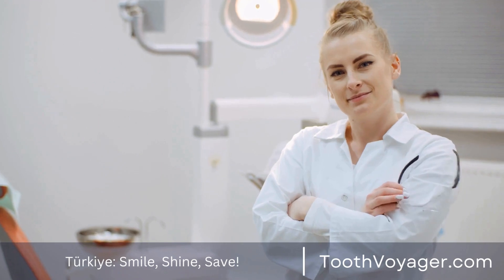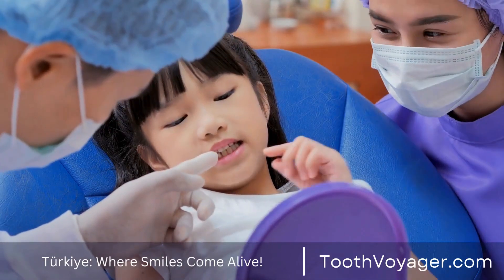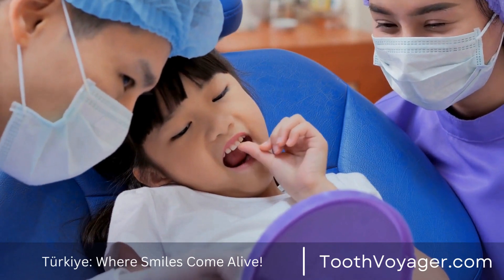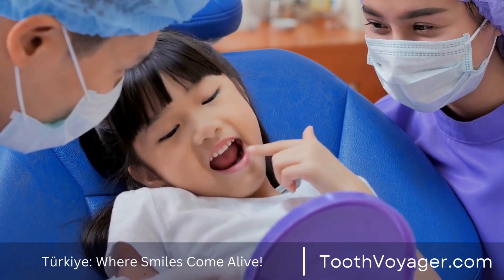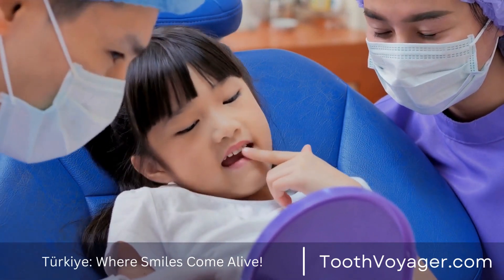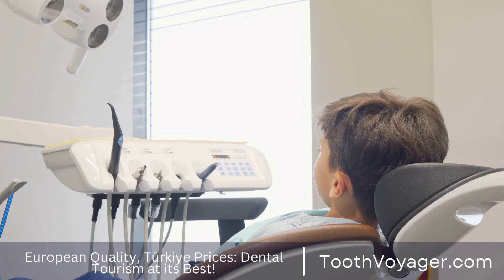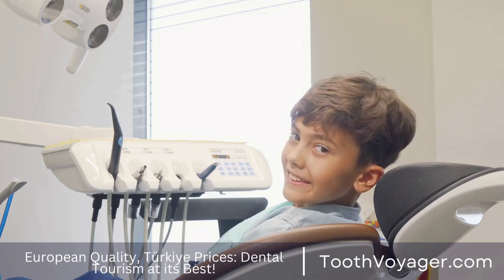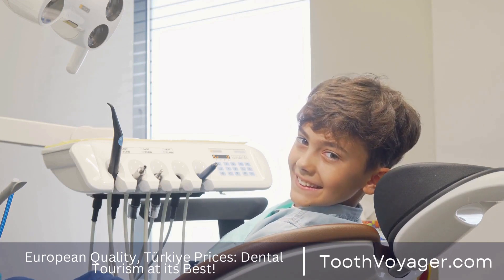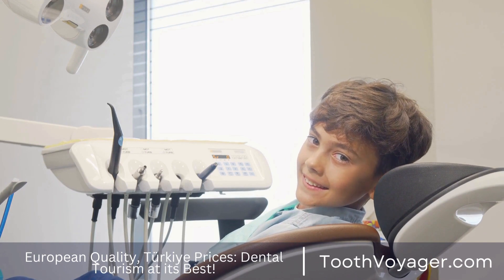Types of dental bridges. There are many kinds of bridges for dental use recommended by dentists, depending on the location of the missing teeth and the state of the surrounding teeth. Most commonly, bridges used in dentistry are the traditional ones, cantilever bridges, and Maryland bridges.